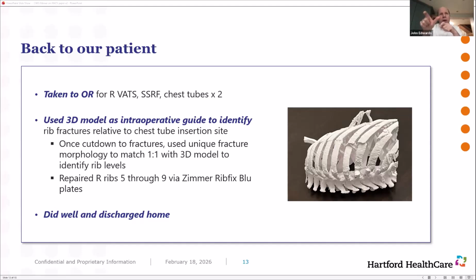You know where you want to put the plate, and you have not a milling system, but an automated plate bender, where you feed a plate into the top of a machine. You press a button, and out of the bottom, like a slot machine, out comes a plate that is pre-shaped to your sixth rib that is exactly right, that takes the human hand away from it.